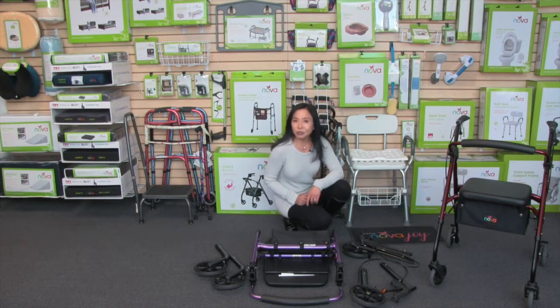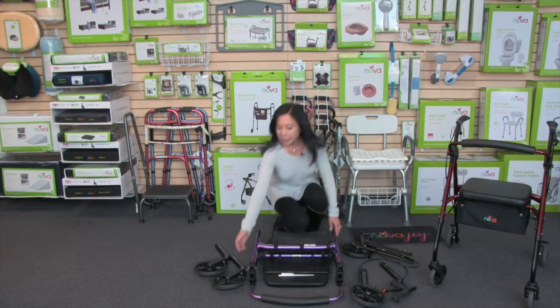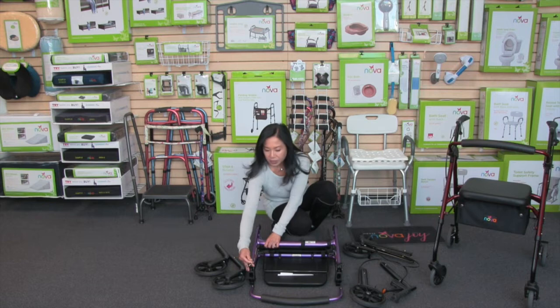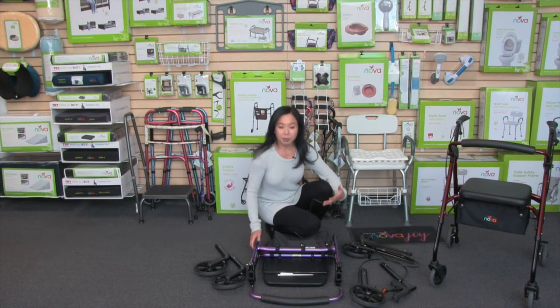The first thing you're going to do is release the lock and lift pin. I'll show you the feature of that later. You're just going to see a pin on the right side of the frame with a key ring. Go ahead and pull that all the way out, and then you can just attach it to the holder right here. So now I can open up the frame.